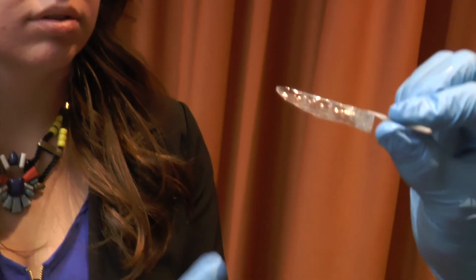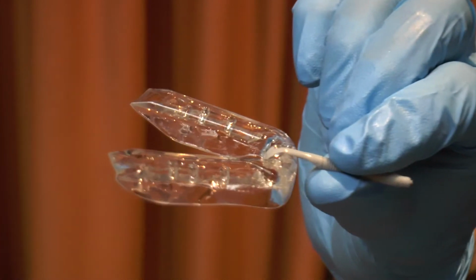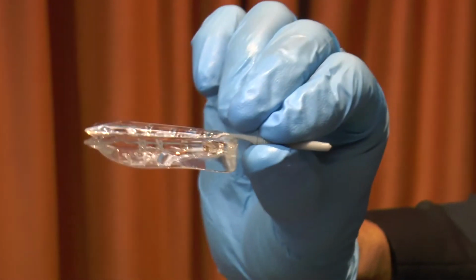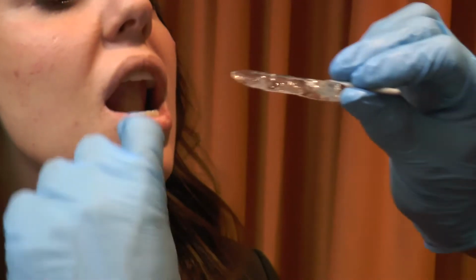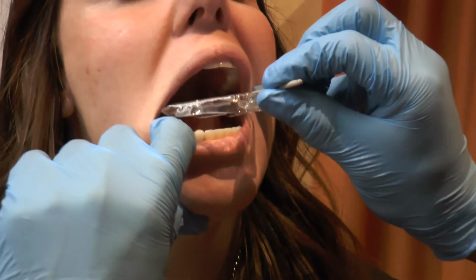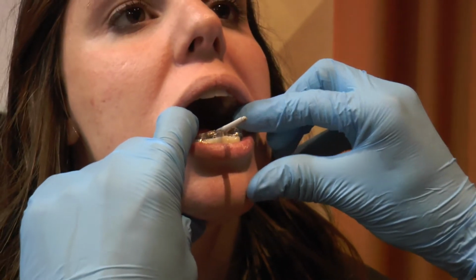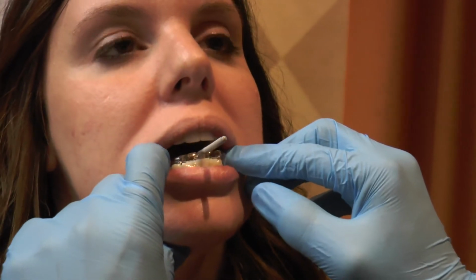So one way to prevent unnecessary bending or voiding of the lingual aspect of the myTAP is to have the patient raise their tongue up while you seat the device in place. So I want you to raise your chin up, open big for me first. Okay, now raise your tongue up. Oh, there you go. Keep the tongue up. And you want to once again make sure this is aligned with the nose and then have them bite down into that.